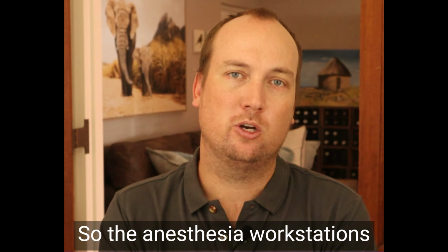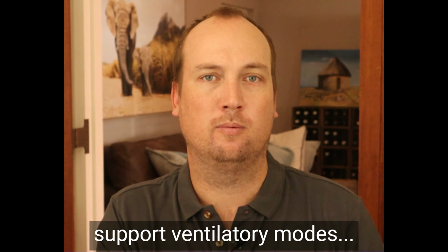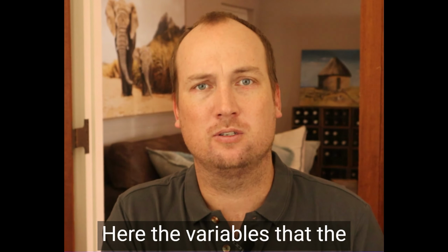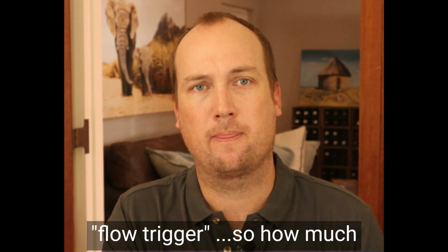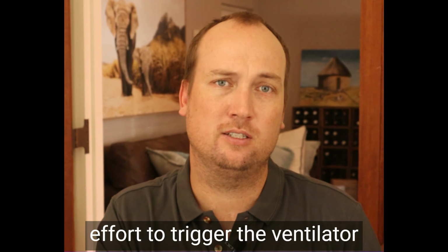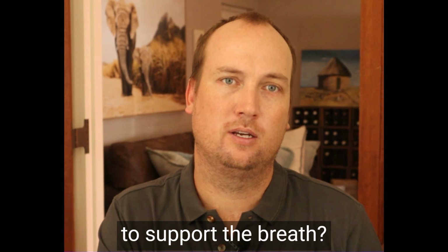So the anesthesia workstations that I work with have a few support ventilatory modes. So the first is PSV, or pressure support ventilation. Here, the variables that the operator can control are the flow trigger. So how much air does the patient have to suck in during their respiratory effort to trigger the ventilator to support the breath?